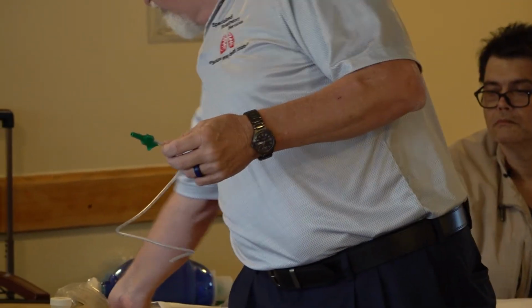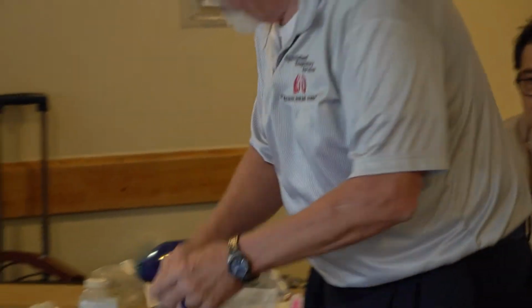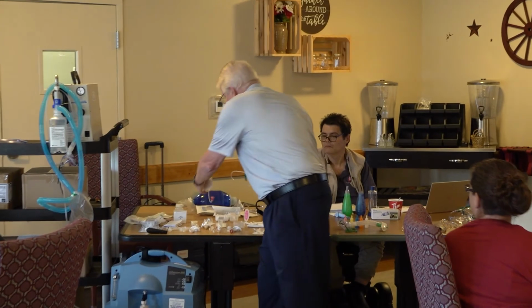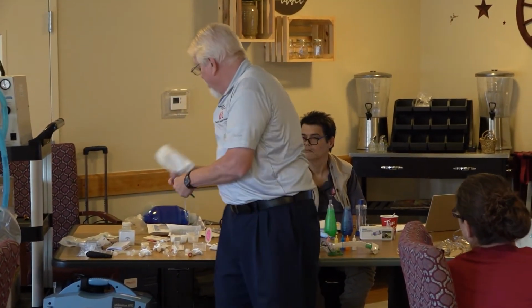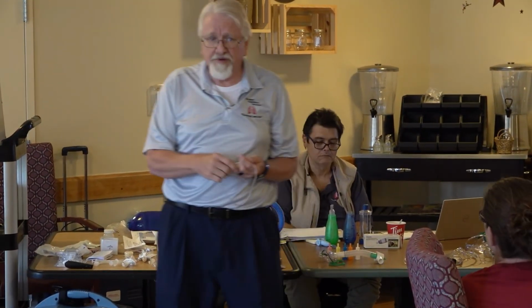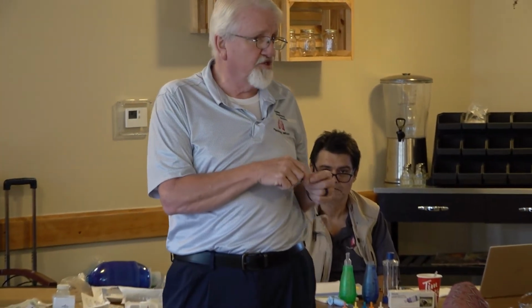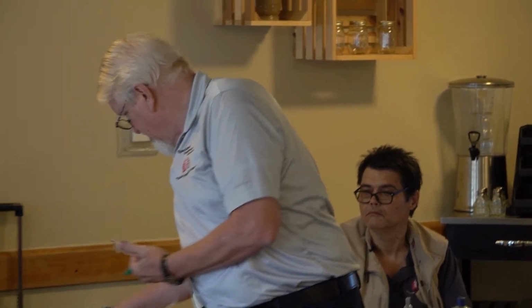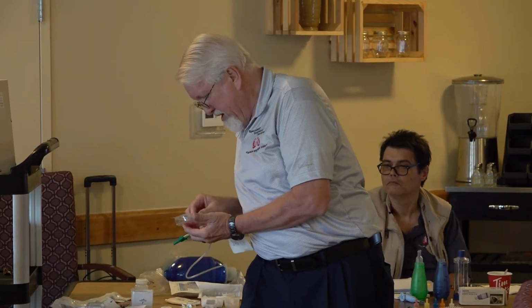So this single-use catheter, which you all should already be familiar with, comes in different little kits. It may be one like this, or there are some more extravagant ones. The big thing to remember with the single-use catheters is that it's a sterile process.